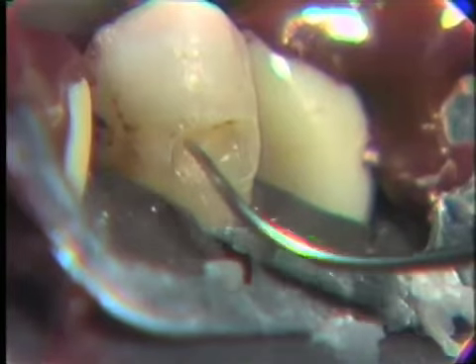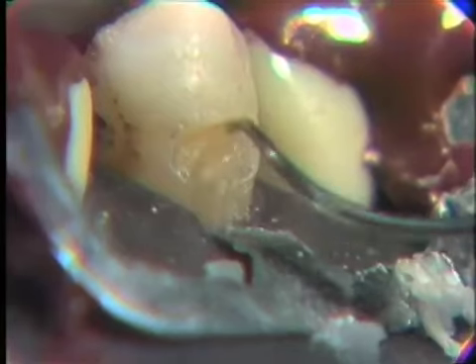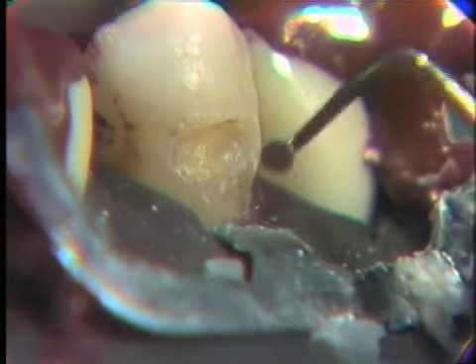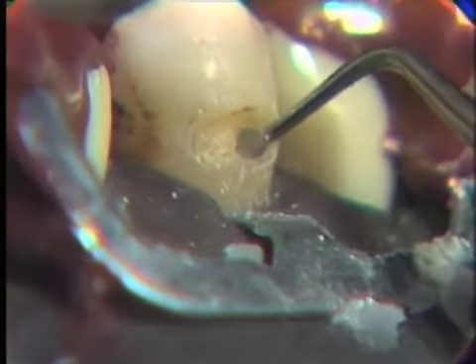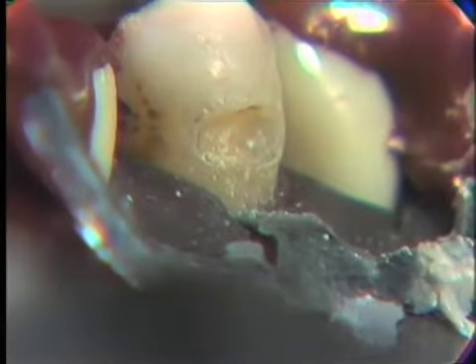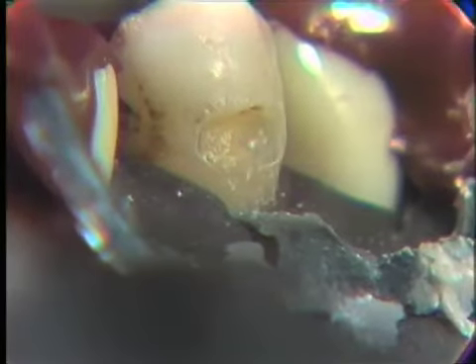We'll test once again. Dentin along here. Now we have just about eliminated all of the soft, possible carious dentin. Take a number 18 scoop spoon excavator. Dry off our site one more time to make sure that we have cleaned out all of the decay.